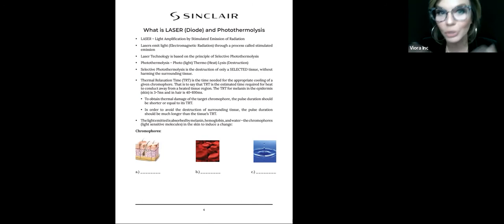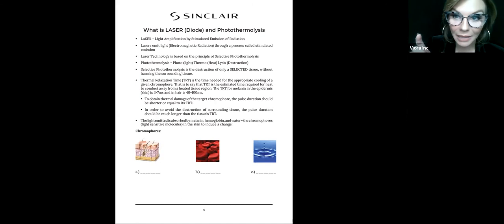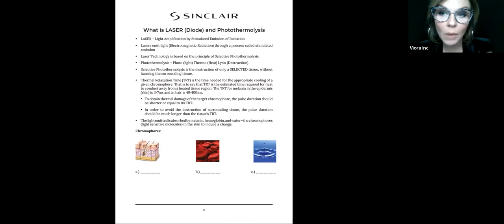And laser technology is based on the principle of selective photothermolysis or photothermolysis. There's different ways of saying that. But what it means, breaking it down: photo meaning light, thermo meaning heat, lysis meaning destruction. So that's what we're doing, taking a light-based technology, building enough heat where we can get coagulation. The reason why we say selective is because we don't want coagulation and necrosis of everything that laser is going to touch. When you put it on the skin, we want to keep the skin safe. We want to kill the hair follicle. So we have the ability of doing that, and that's why it's selective. We're going to keep them safe, but get rid of that unwanted hair.